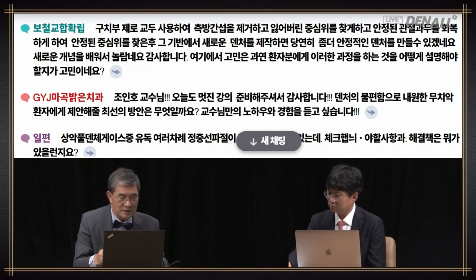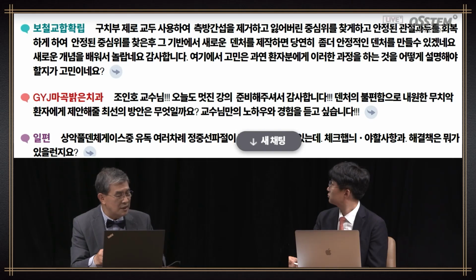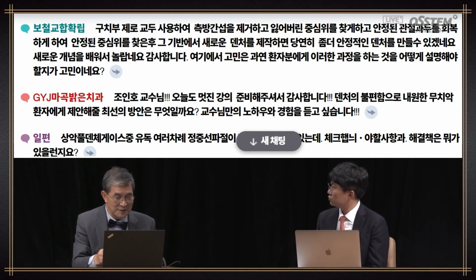You use the posterior 0-degree cusp teeth. Lateral interference was removed and lost CR was found. A stable TMJ condyle was recovered to find stable CR. Based on that, a new denture is fabricated to make a more stable denture. This is a remarkable new concept that I learned in this hour. But I'm thinking, how can I explain this process to the patients?